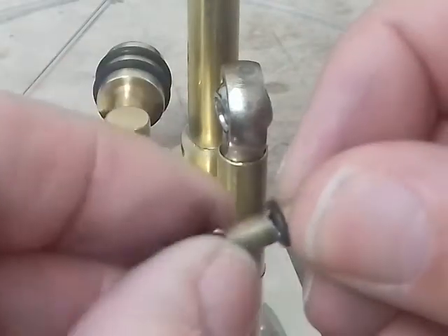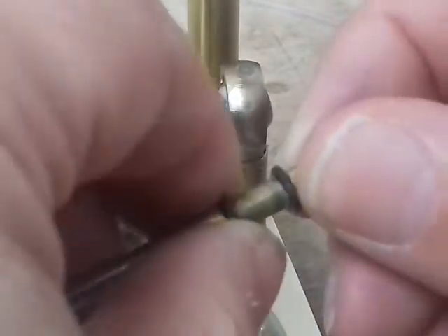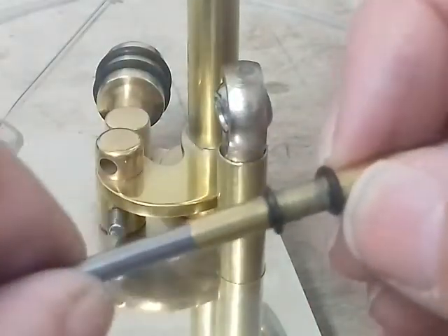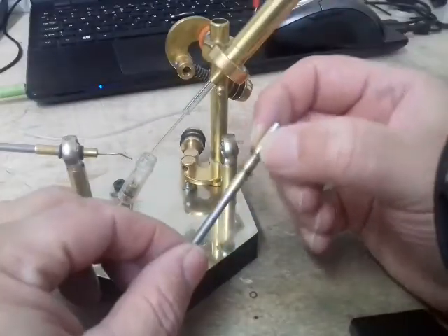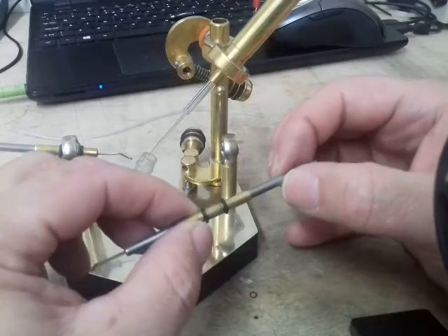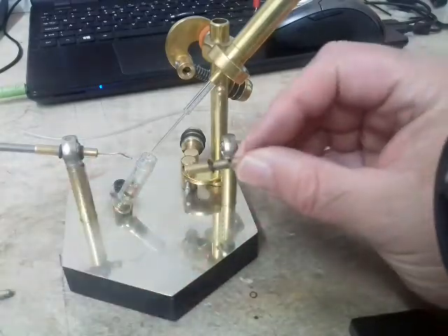You've got two of those, one there and one there, so when you push the tube inside, the O-rings penetrate through into the inner bore and actually hold it really tight. You can see it will not move. It's a foolproof system. It's quite tight. You have to pull it, and there's enough pressure there to hold it. It won't move back the other way. It's just something I came across by chance.